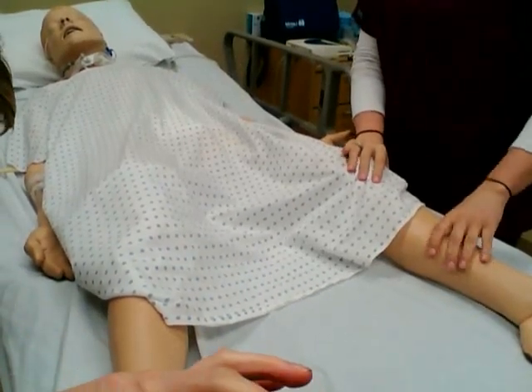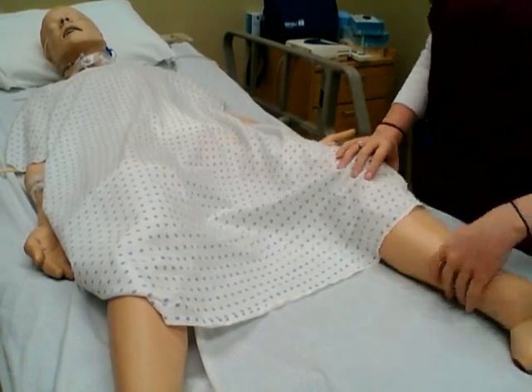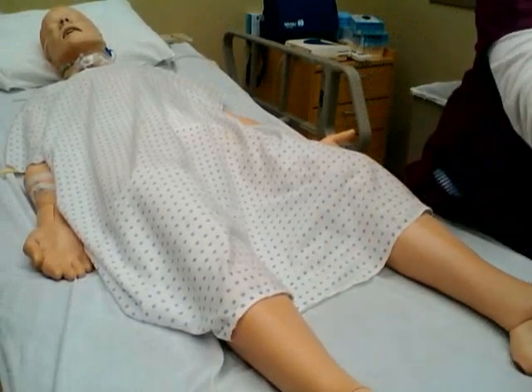You want to make sure you get your lab specimen to the lab within 15 to 30 minutes to make sure that it is still good for the lab and no bacteria grows. And that is it for the skills validation.